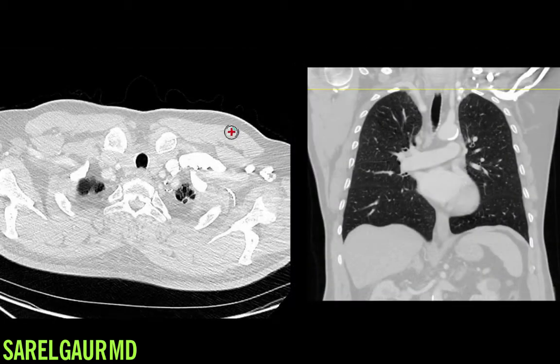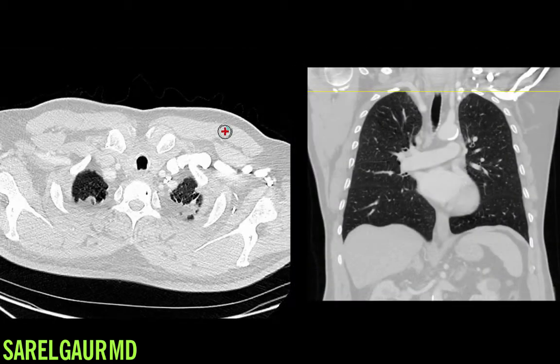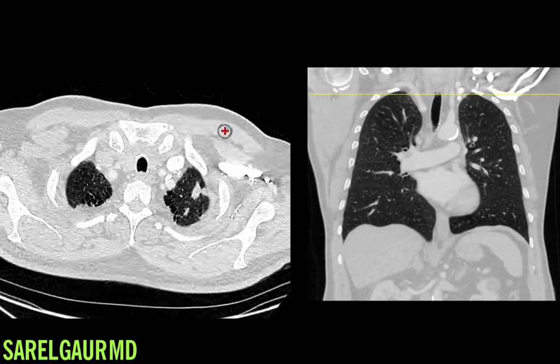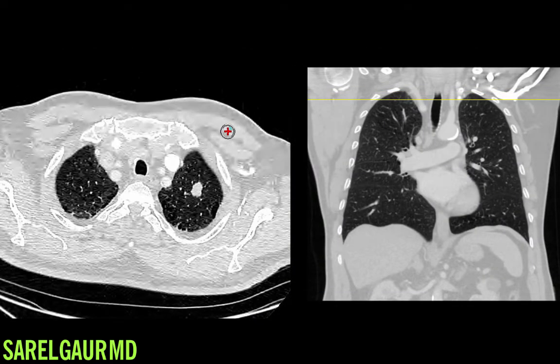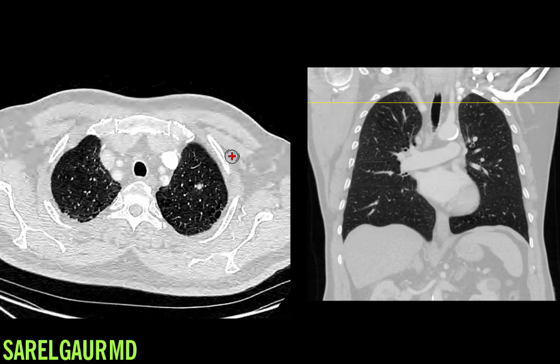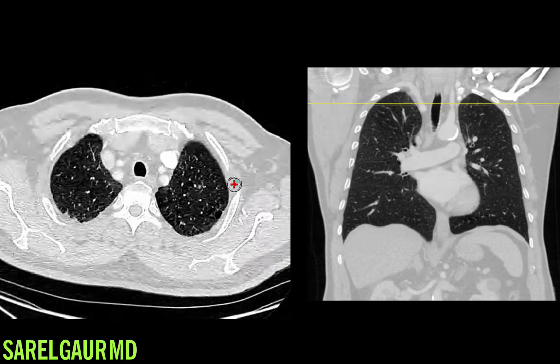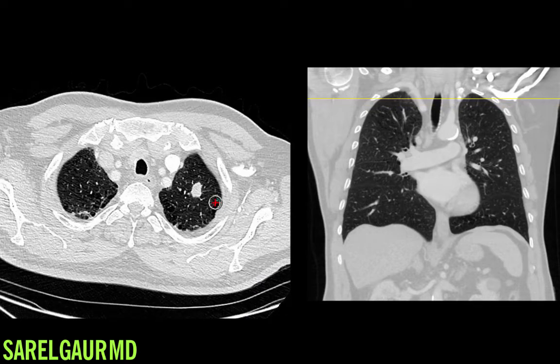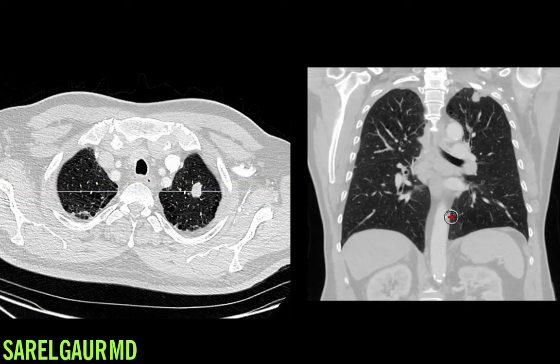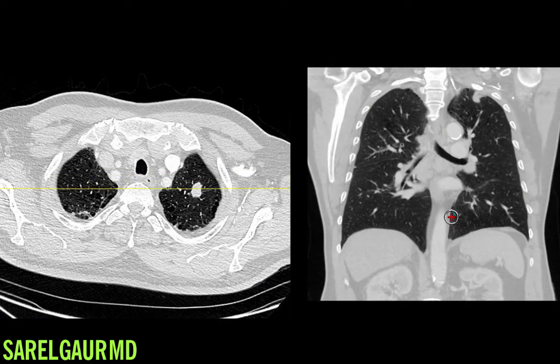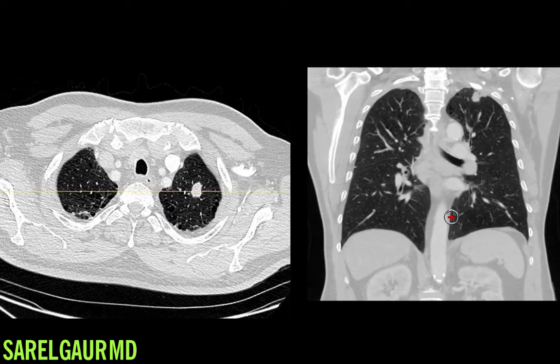Here are the chest CT images. I can see that the finding on the chest x-ray corresponds to this nodule. Now when I see a nodule, I go through a checklist to evaluate what that nodule could be.